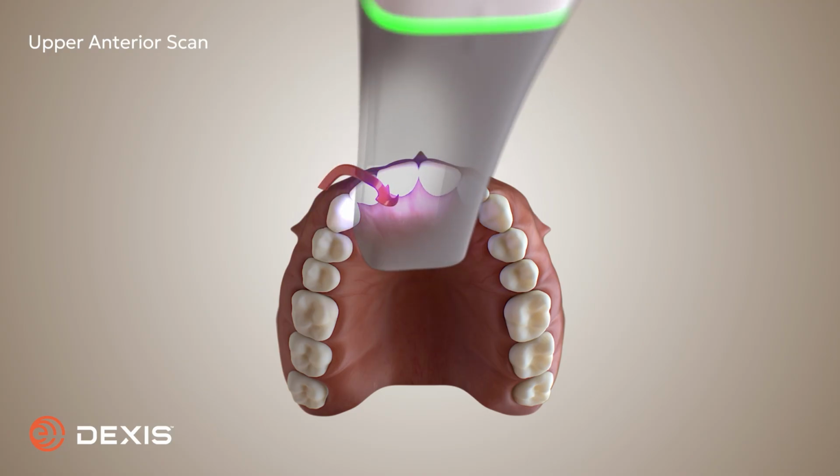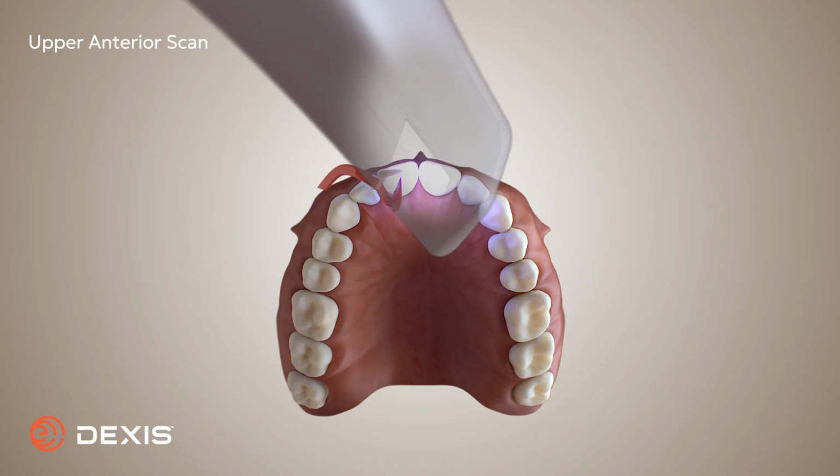Press the mode button to select the opposing arch and follow the same recommended scanning pattern.